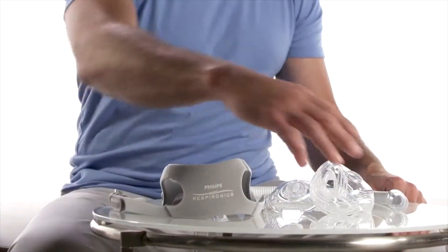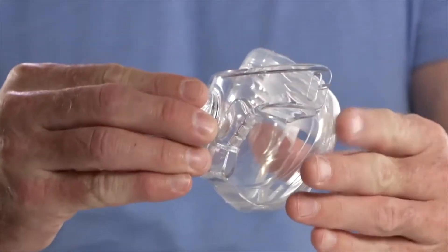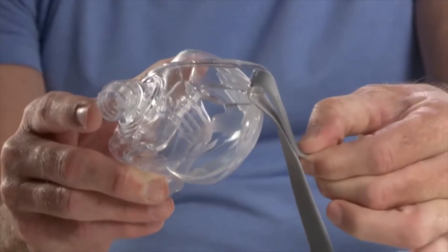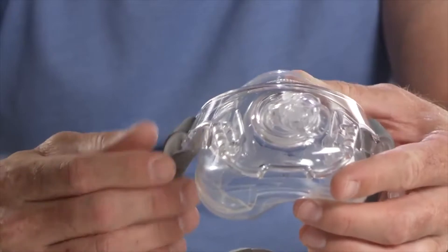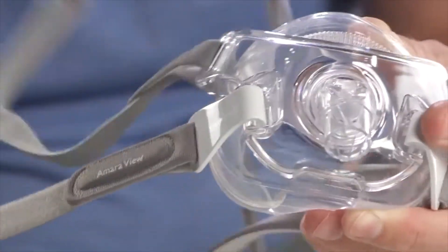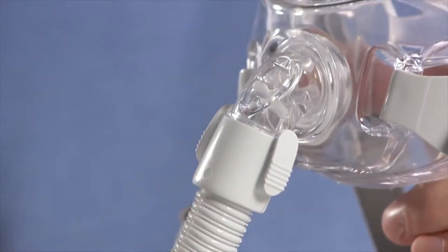To reassemble the AmaraView mask, grasp both sides of the mask cushion and gently press it into the mask frame. Thread the headgear straps through the mask frame slots. Push the headgear clips onto the mask frame. Press the quick-release tube onto the elbow until the quick-release tabs click into place.